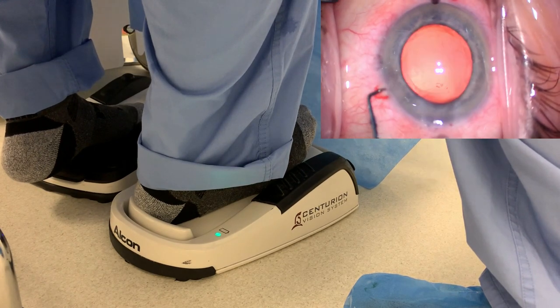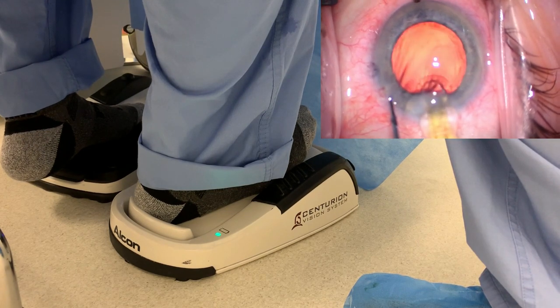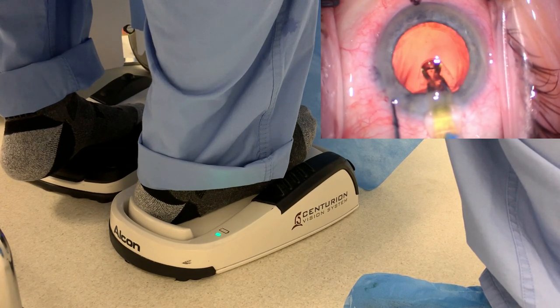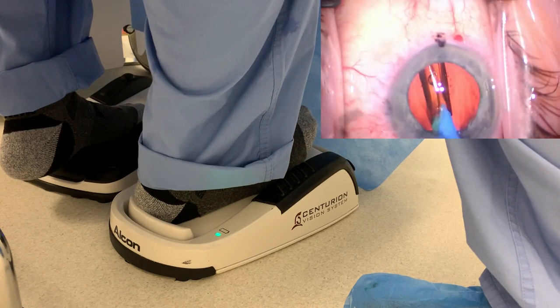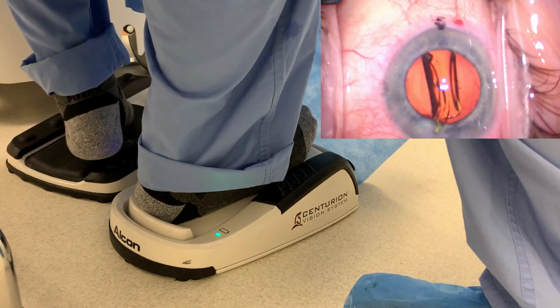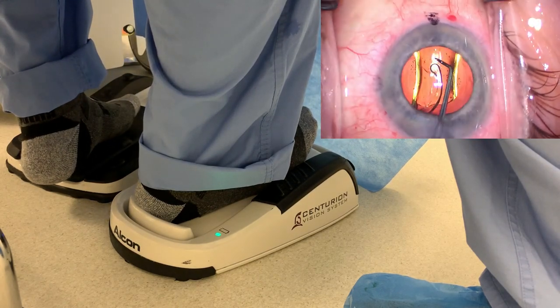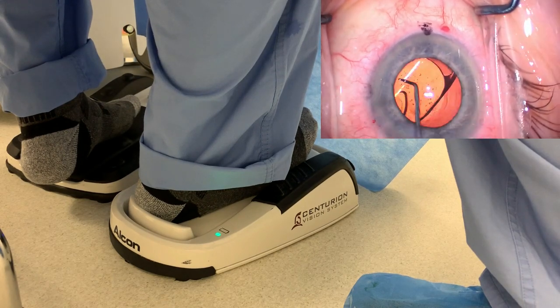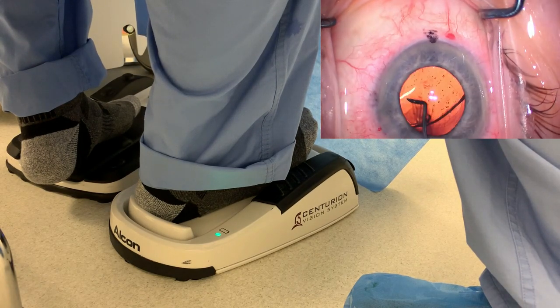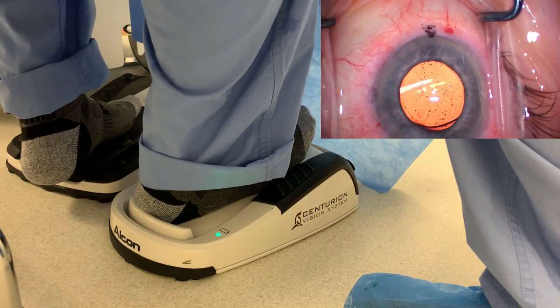We don't need the foot pedals here, and now we deliver the lens. I'm only going to show one video of this foot pedal maneuver because this is something you should learn on your own. You're not going to watch your own feet as you operate — when you drive a car, you're not watching what your feet are doing. That's something you need to learn without having to really look at it. We made this video because there's a lot of interest from beginning surgeons to know what the foot is doing at each point during surgery.